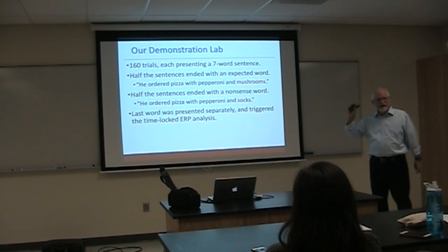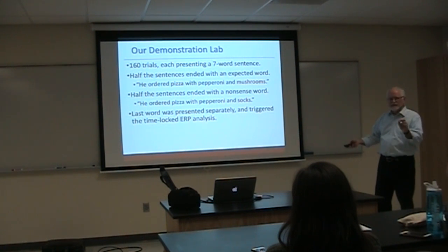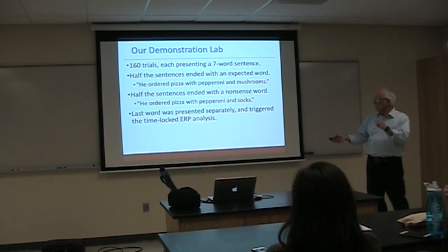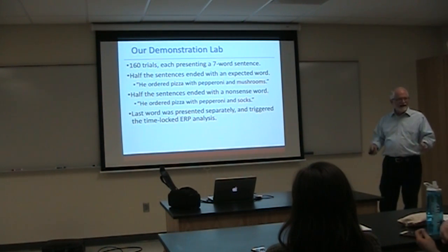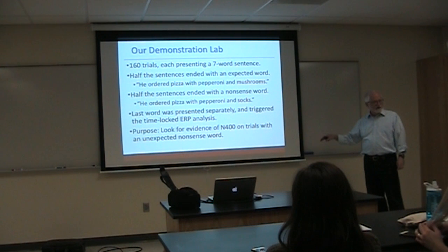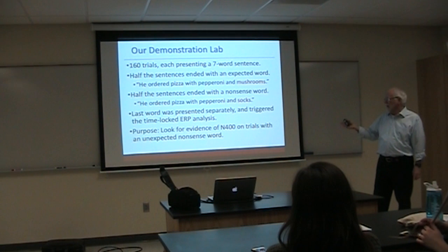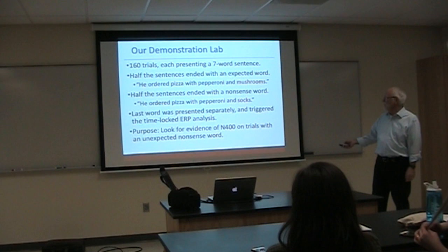Okay, as those of you just saw or heard me talk about in the tour, the first 6 words were presented, and then there was a pause, and the last word was presented. That last word made it either a normal sentence or a nonsense sentence, and so that's where the trigger was sent to the EEG computer so that we can do this time-locked ERP analysis to the presentation of the last word of the sentence. So the purpose of this demonstration experiment was to try to replicate the original experiment having to do with the presence of the N400 on nonsense trials.